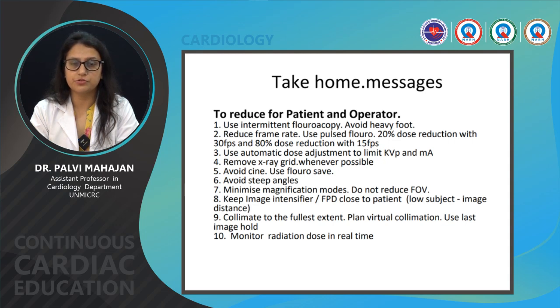Minimize the magnification modes. Do not reduce the field of view. Keep the image intensifier close to the patient. Low subject image distance. Collimate to the fullest extent. Plan the virtual collimation and use last image hold. Monitor radiation dose in real time.